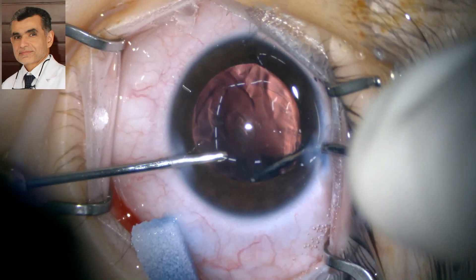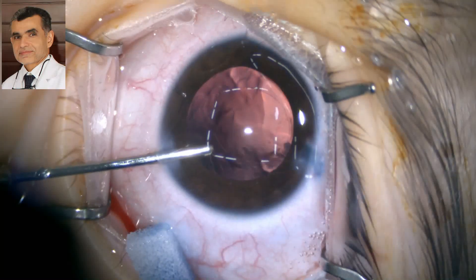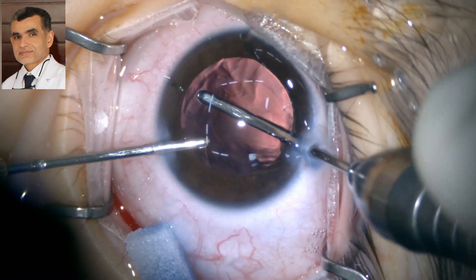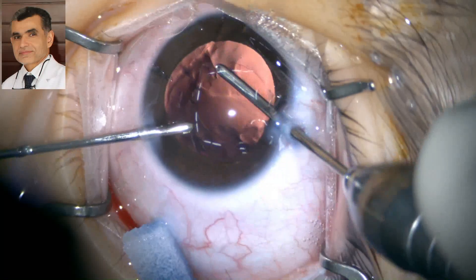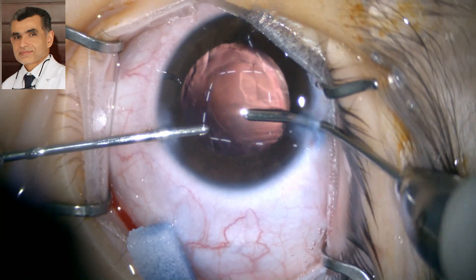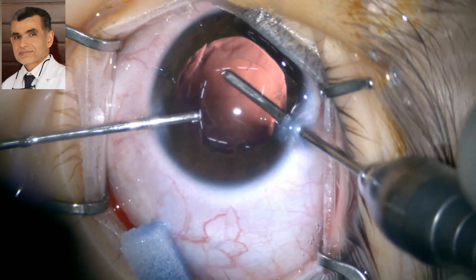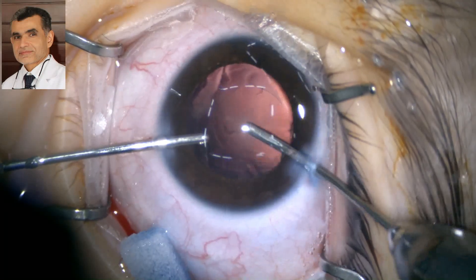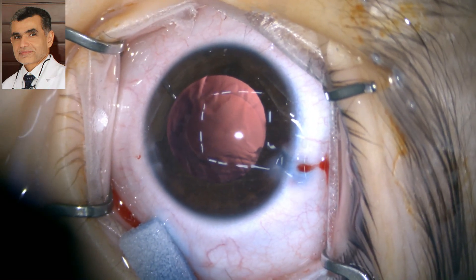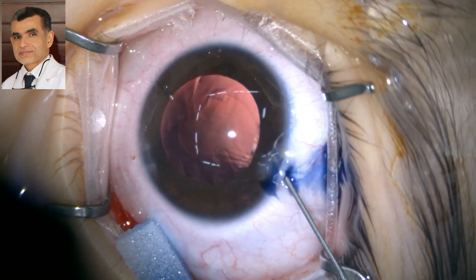We are polishing the anterior capsule as well using the low vacuum of the irrigation-aspiration. Because posterior capsular opacification in children is 100%, we have to perform a posterior capsulotomy as well. We are making sure the anterior capsule is cleaned fully and meticulously — this will make a difference, especially for capsular contraction.